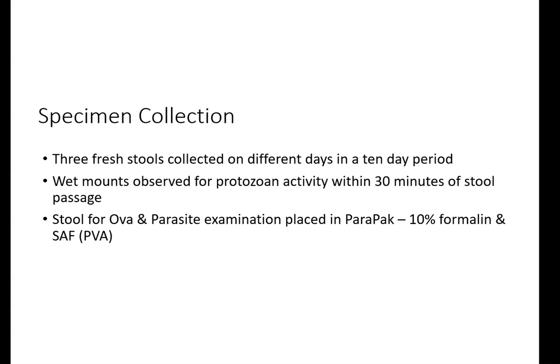We get O&Ps, which are ova and parasite collections, and typically you get three fresh stools from different days, so you don't collect all three on one day. You collect them within a 10-day period, and when the person collects them, they're given a para pack to put their stool in. And there's a little scooper to get the stool and put it in the formalin, the SAF or PVA, whichever it is, that will help to preserve it.